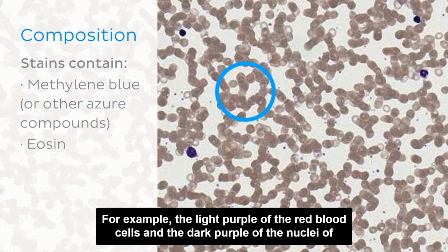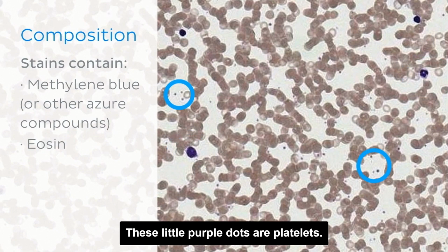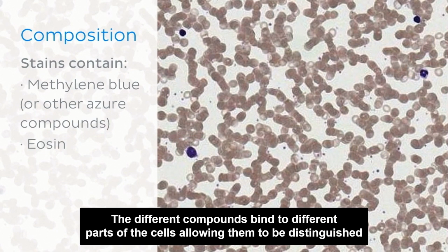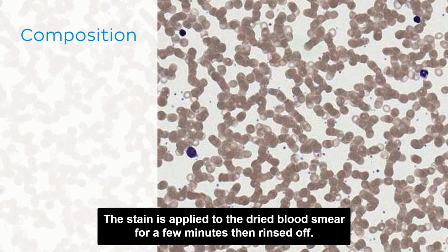For example, the light purple of the red blood cells and the dark purple of the nuclei of white blood cells, known as leukocytes. These little purple dots are platelets. The different compounds bind to different parts of the cells, allowing them to be distinguished from one another. The stain is applied to the dried blood smear for a few minutes, then rinsed off.